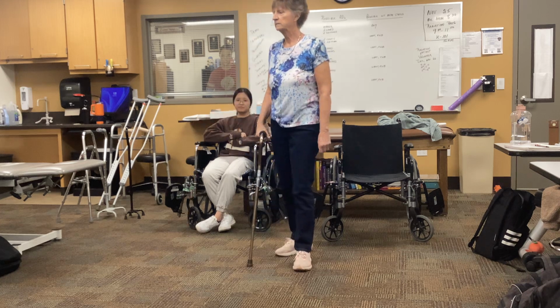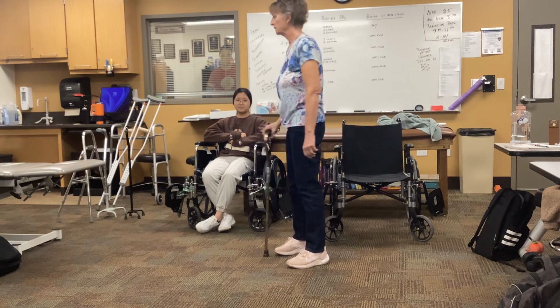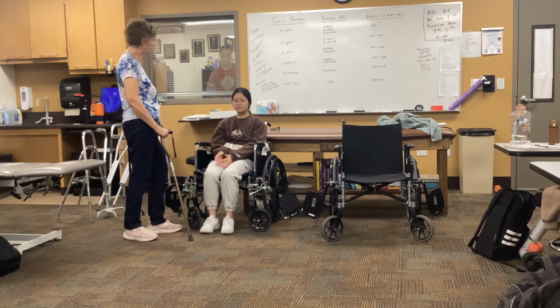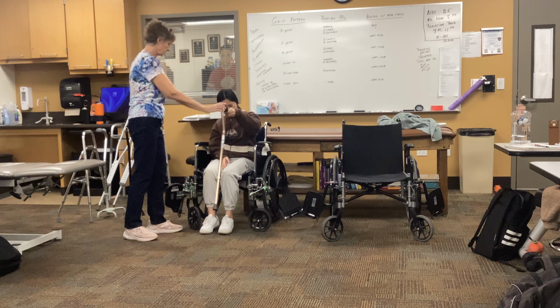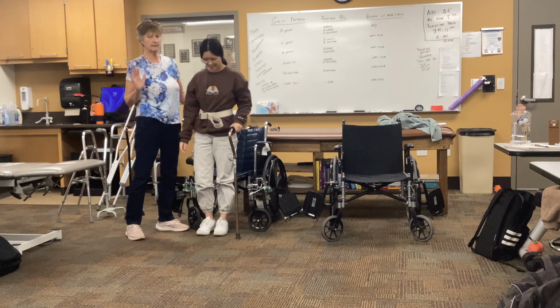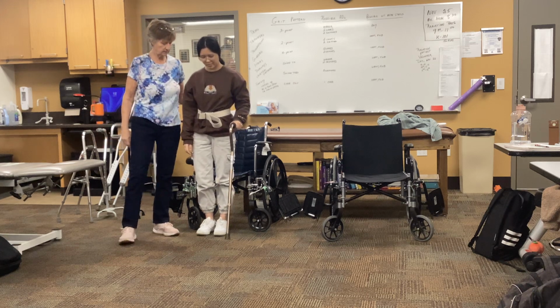Doesn't matter which one you're using. Okay. All right, so which side's your bad leg? Okay, so which hand does this go in? All right. Okay, still gotta slide forward and stand up, because that helps bring your body over your base of support quicker and more securely.